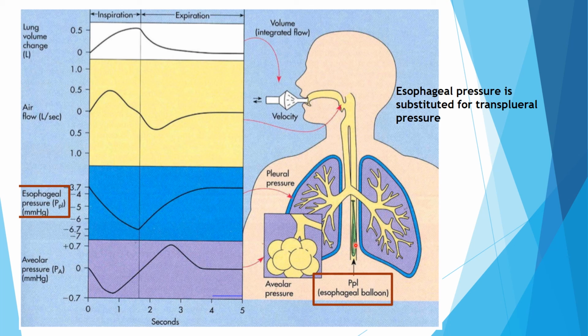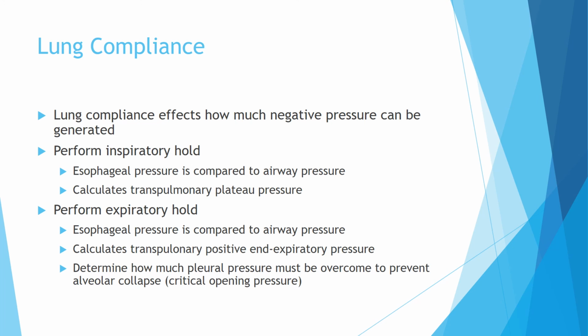And just FYI, once the esophageal balloon is in proper place, first, it's going to be connected to something. It's not just going to be sitting here like this dude swallowed a balloon. And second, your heart is going to be right over top of it here. So once you're dropping this in, you're going to see some cardiac oscillations, and that's how you know it is properly positioned.